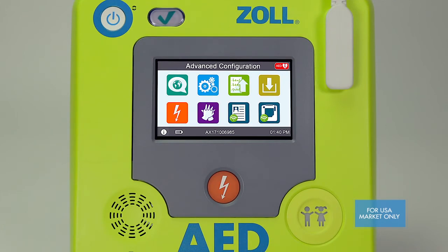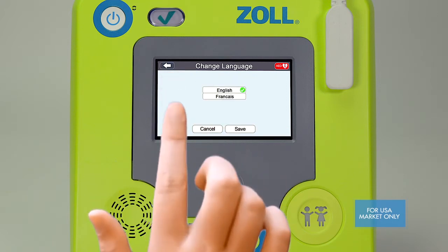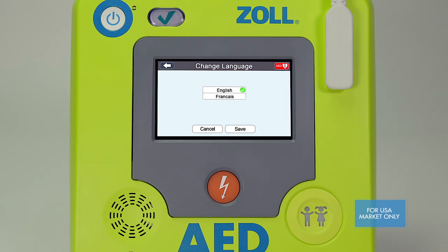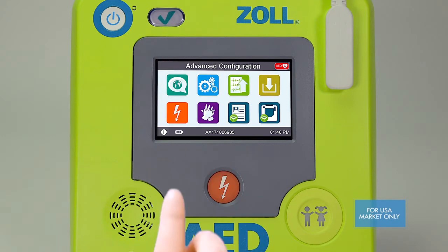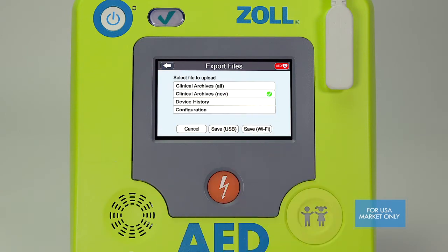In advanced configurations there are eight icons. The language icon and green arrow export icon have identical functionality to what you saw in the previous basic configuration screen. The language icon allows you to change the language of voice and text prompts on your AED — note that language options differ by region and you may have only one option. The export icon allows you to export configuration files or clinical case files to a USB drive or over Wi-Fi.